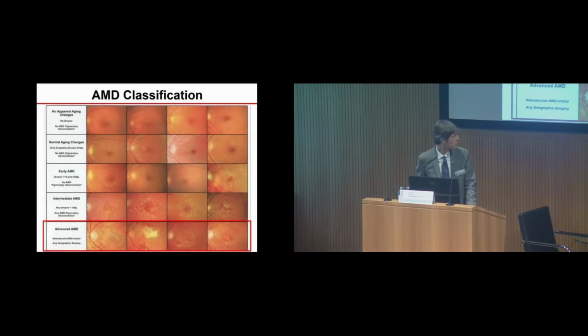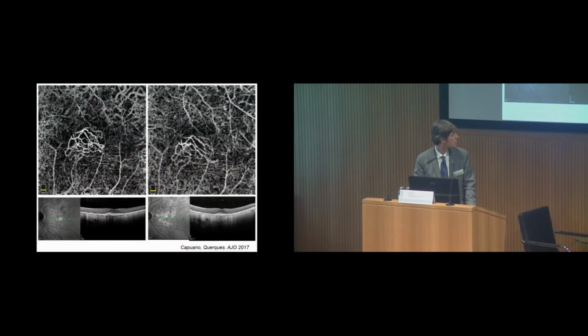I will finish with the atrophic form of advanced AMD, so geographic atrophy. Just to show you that in several cases of foveal preservation, and in general of preservation in the context of a geographic atrophy, we may have this type 1 neovascularization. This type 1 neovascularization is still quiescent, 6 months apart. There's not much change in the neovascularization. These new vessels appear as arterialized, so not much capillaries inside the neovascularization.